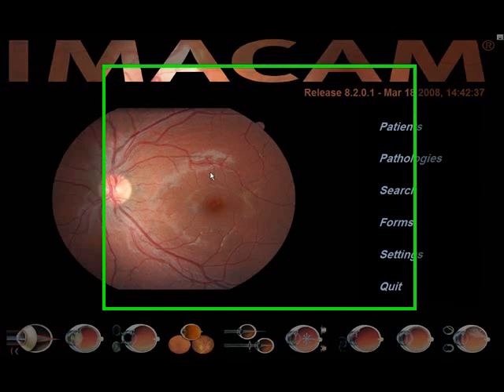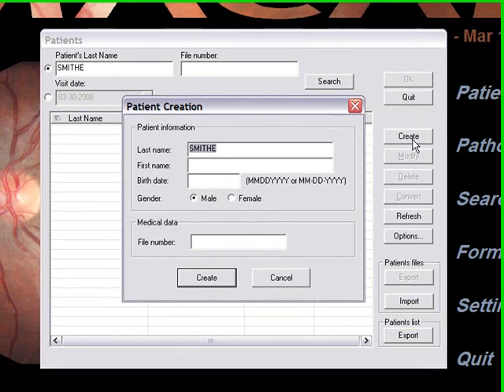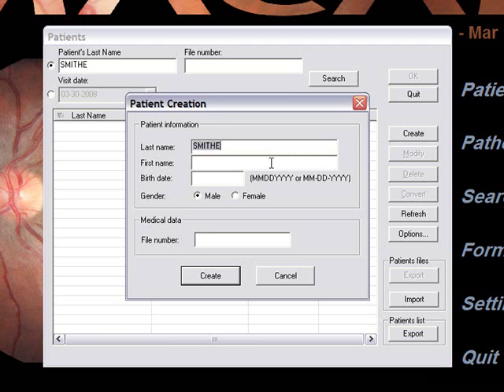To create a patient record, be sure your Caps Lock is on and click on Patients. Be sure the box is checked next to the patient's last name and start entering the patient's last name, then click on Search. If the patient's name does not show up on the list below, left-click on Create. Tab or use the mouse to move to the first name, date of birth, and gender, and enter twice when completed.